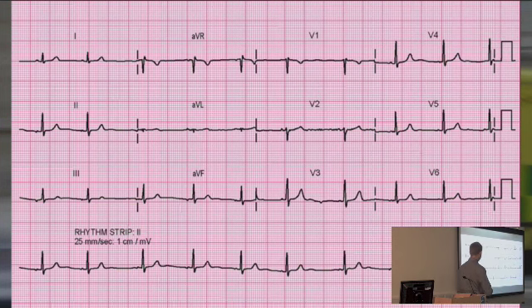We're going to look then at the rhythm. So then we'll look at lead 2. If we want to go through those 6 questions, we can, but we could just say if we're happy, it's normal sinus rhythm. Going into rate, whatever it is, 75 beats per minute. And then we're going to look at the axis of the heart. Both thumbs are up, so it's a normal axis.